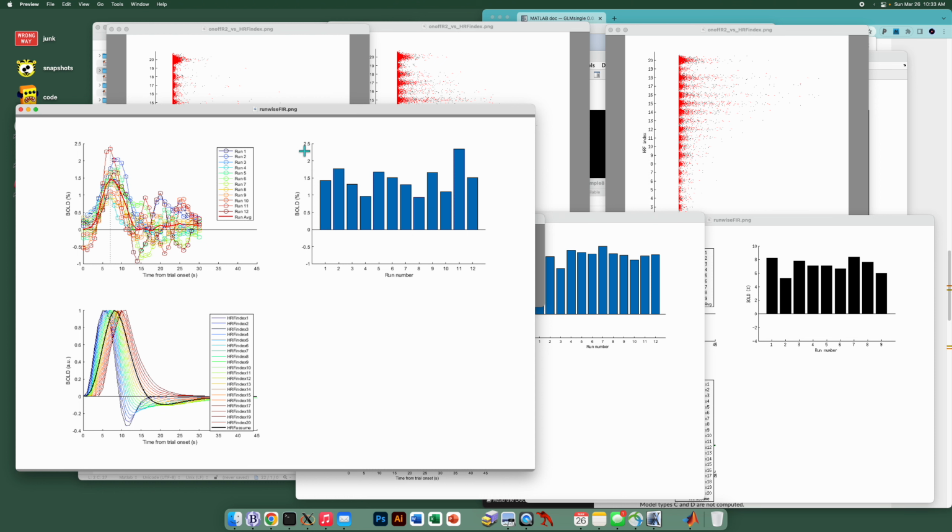In particular, if you notice that one run is completely bad, in the sense that there's no evoked responses or it looks weird, this can give you some clue as to potentially excluding that run. Finally, at the bottom, we get a visual depiction of the HRF library that's used in GLMsingle. So the rainbow colors from 1 through 20, that's the default. This is the HRF library, which was convolved with the stimulus duration you provided to give these time courses, and we're visualizing that.